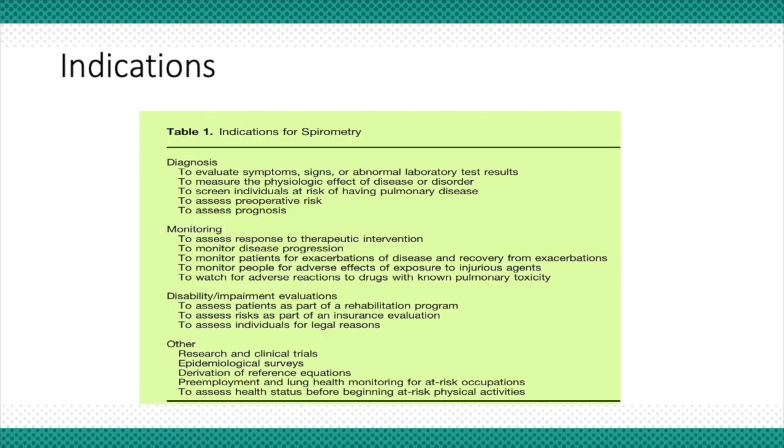As I was saying, there are a few boxes which mention tables, which mention indications and contraindications. So if you are giving an exam, these are really helpful. Generally, we know we use spirometry for diagnosis, but we remember that it is basically to check the physiology, the effect that a disease or disorder has on the physiology of the lungs.